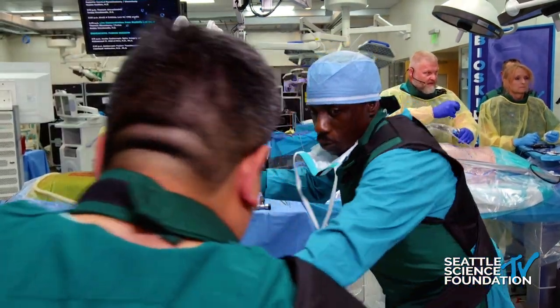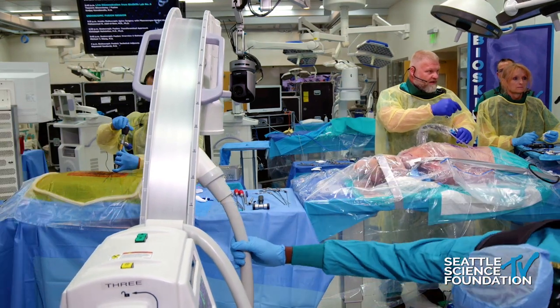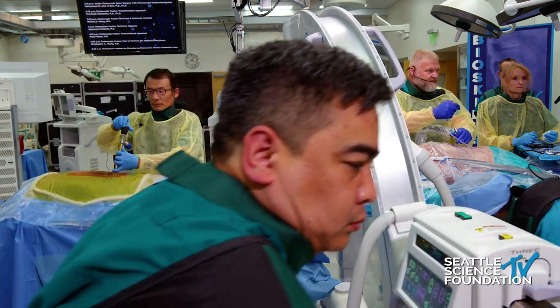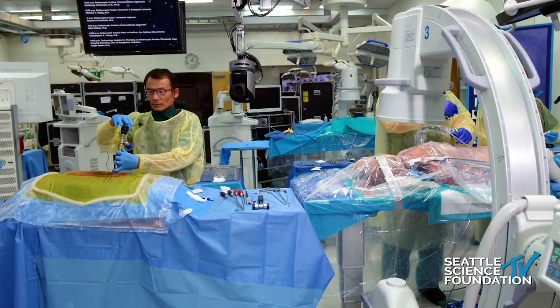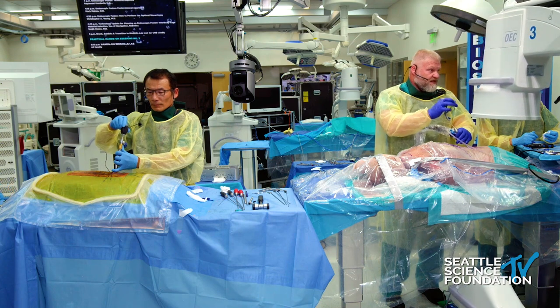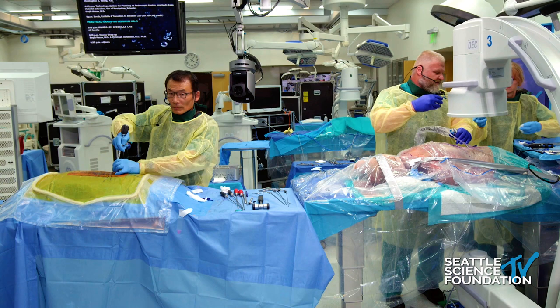So basically, I like to go into the foramen, clear it out, make sure that there's no nerve here, find my disc space, open my annulus, and then it's whatever system you're using, that's the system you're going to use to clear out your disc. There's some variability there.